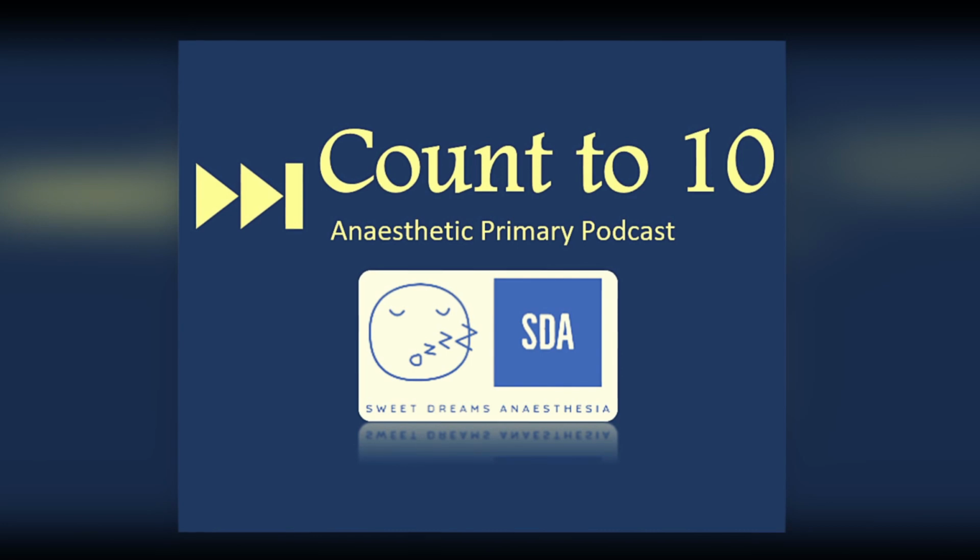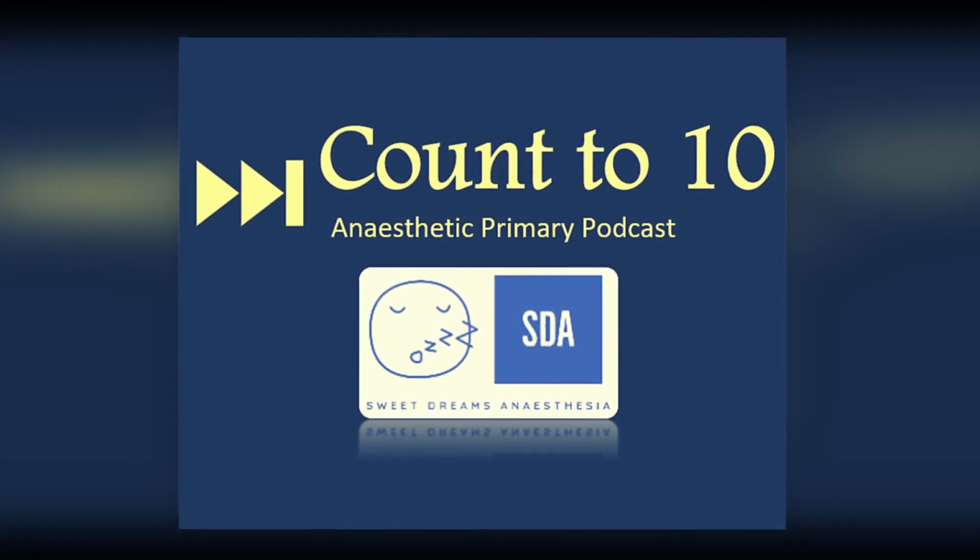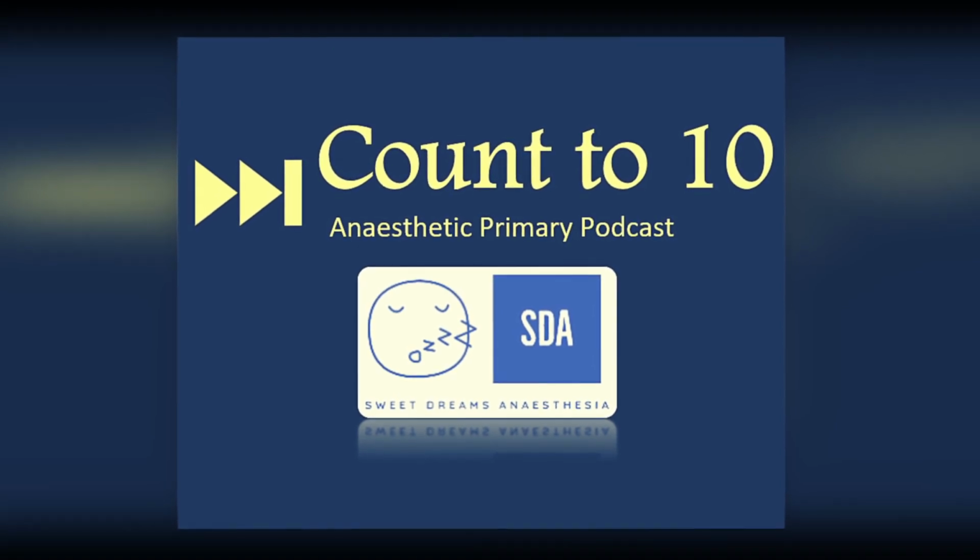As per the examiner report, the major domains assessed here were the system components, the Beer-Lambert law, the differential absorption, the isolation of the pulsatile component, and then the converting ratio of the R to our saturation. What appeared to be the common problems here was incorrect use of terms such as SaO2, SpO2, and PaO2, the misconception that infrared light is the only light that's used in the pulse oximeter, the limited or no application of the Beer-Lambert law, the incorrect or contradictory statements about the absorption spectra of oxyhemoglobin and deoxyhemoglobin, and then absent or insufficient explanation of the pulsatile or the alternating current compartment.